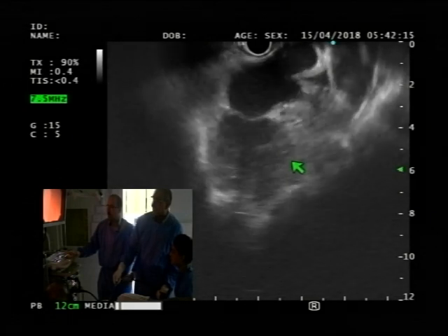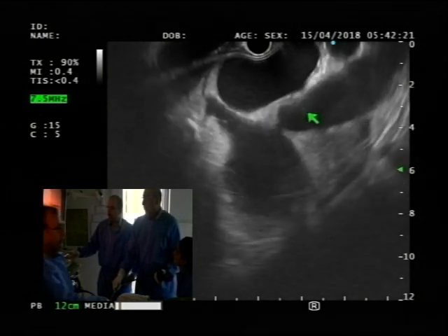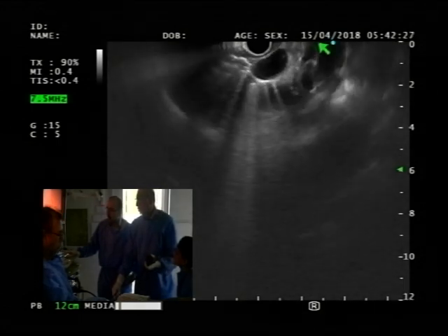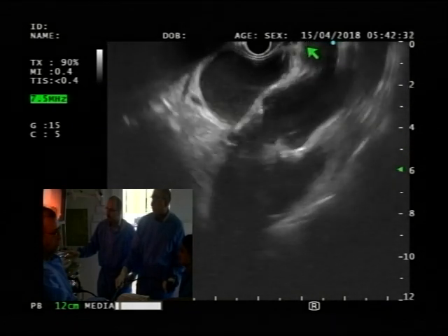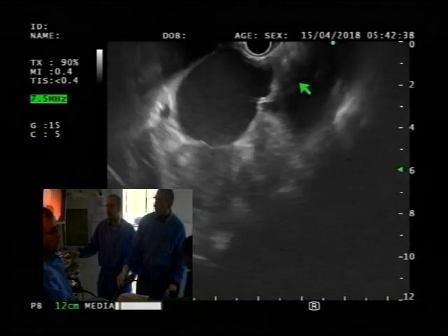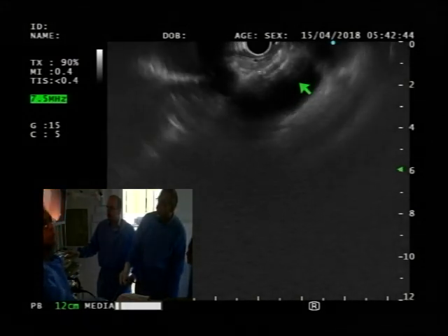That's the aortic. Yeah, so go clockwise a bit. And there's your aortic outlet going into the aorta. Beautiful. That's right. And then up here is where you want to look for the nodes. So pull back and spin over that a bit. There, pull back some more. Right there is the subcarinal, station 7 in terms of numbering. Okay, good. Now go counter and find the aortic root.